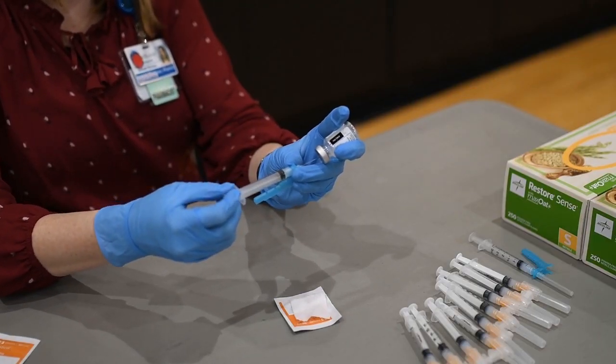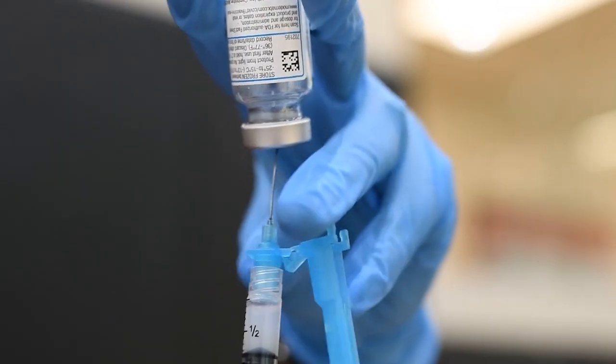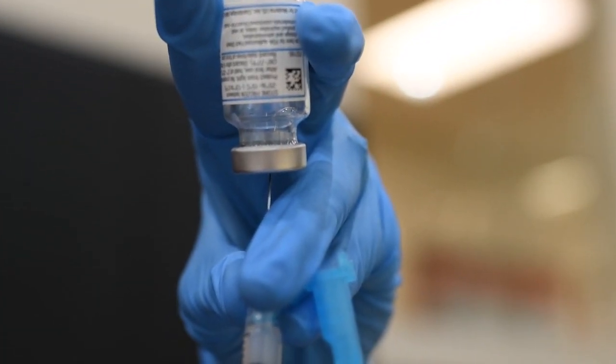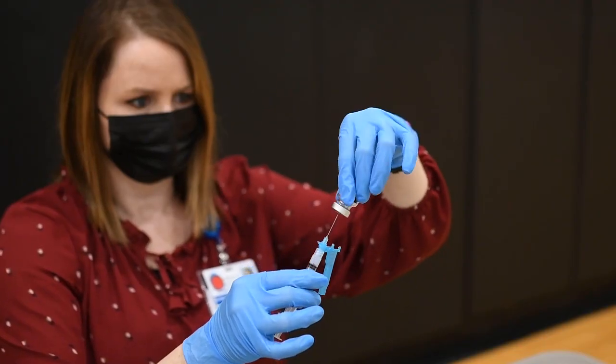Draw at that angle to remove the last droplet possible, and also note that below where the eye level can see, there may still be some additional serum below the rubber stopper. So you may also need to draw from within there. Then ensure that you have your full 11th dose at the full 0.5 ml.